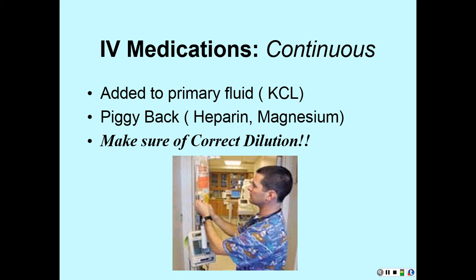Now, the great thing about that is we now have those bags coming to us that are already mixed. You can buy them that way. We used to have to add it every time. Okay? But when it starts coming to us from the manufacturer like that, it cuts out that potential error by somebody having to add the fluid. But you may be the one having to add it. Never say that you'll never have to add. Okay, it may come to you in piggybacks.